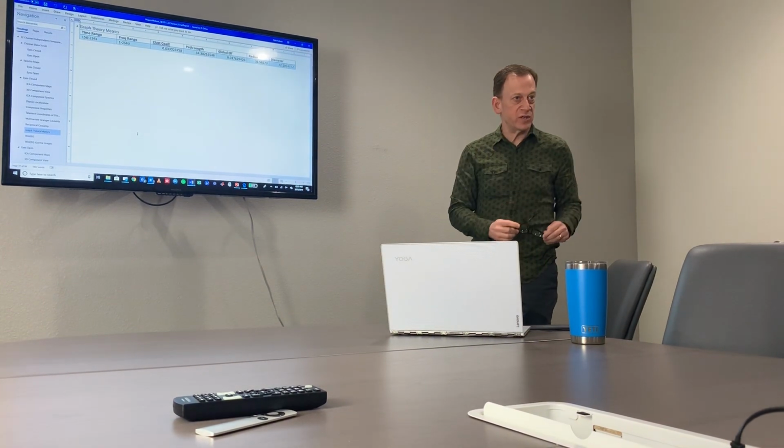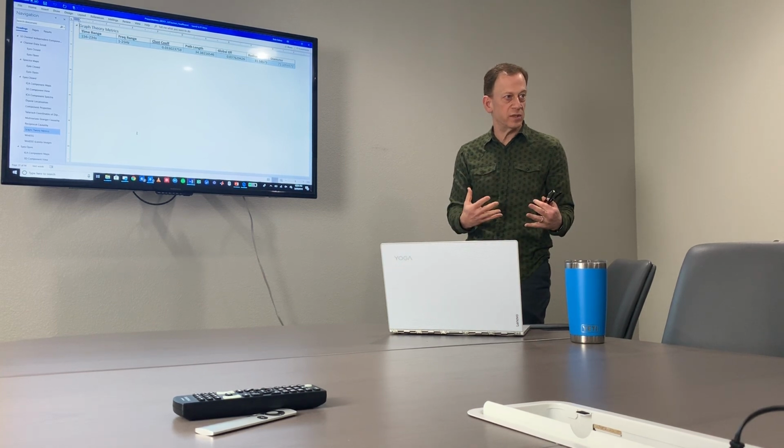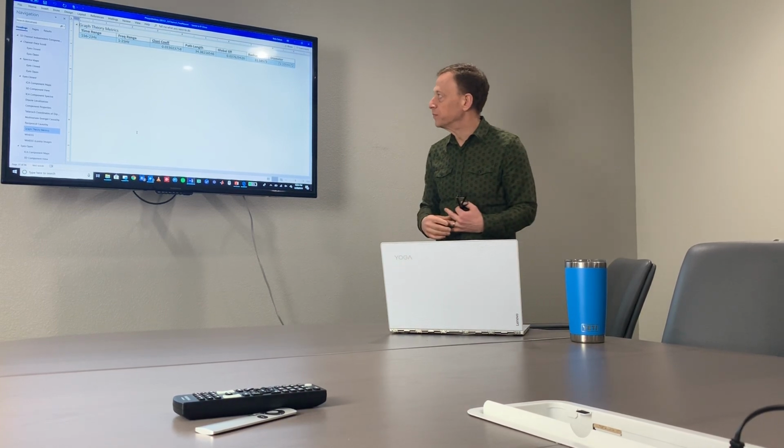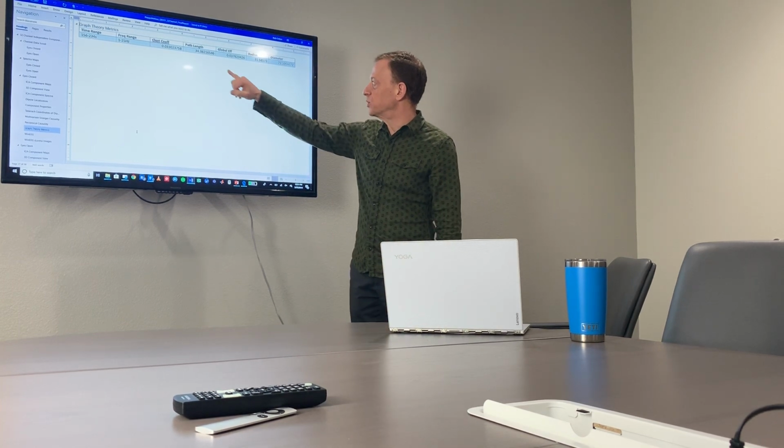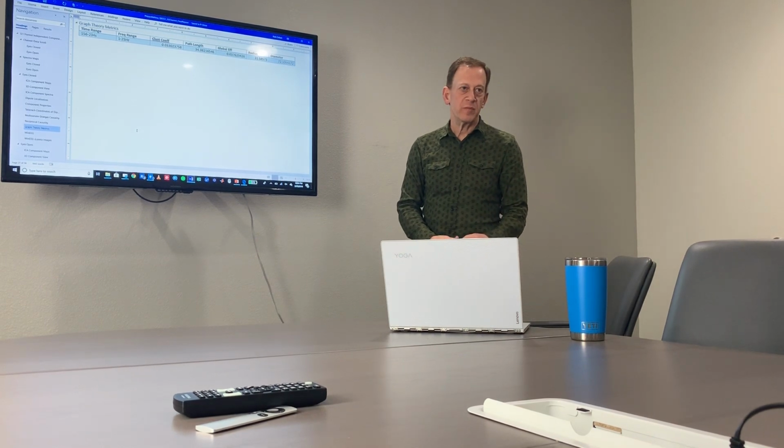From all of that, we go to something called graph theory metrics, which is a statistical way of grouping all of those measures of connectivity into one statistical measurement. Okay? So the one we look at the most is what's called path length. Hers is a 34. Path length is the average efficiency of the connections across all possible connections that we've looked at.